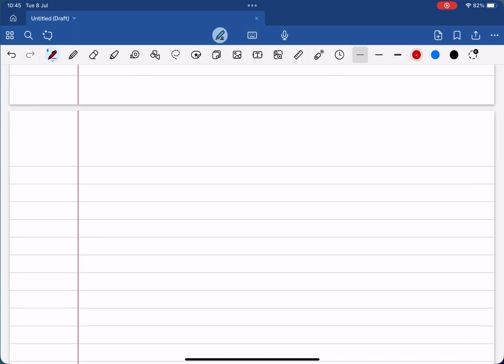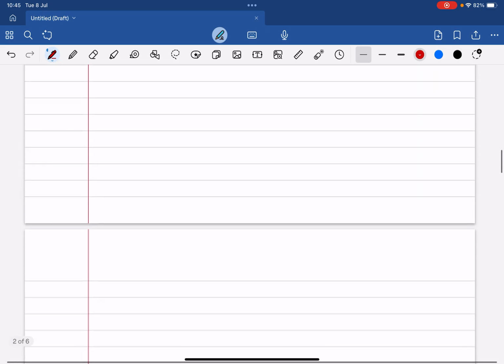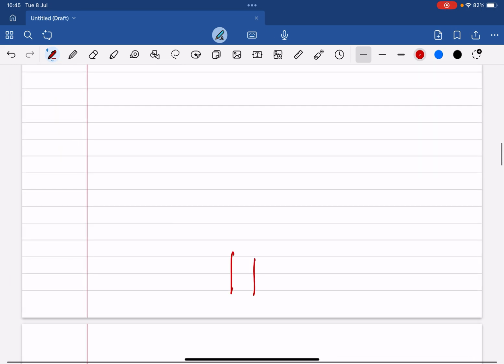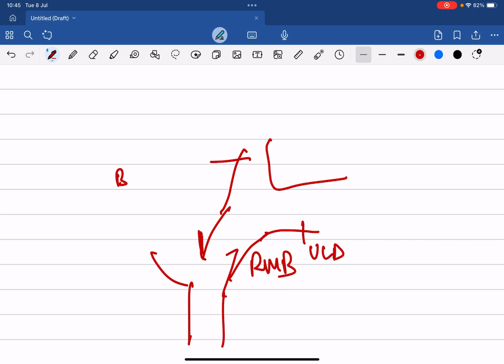When we enter inside the right side, this is the trachea, and we see the carina here. When we enter the right side, this is called the right main bronchus. The right main bronchus is further divided into two main structures. One is the upper lobe division. This is called bronchus intermedius, BI, on the right side.